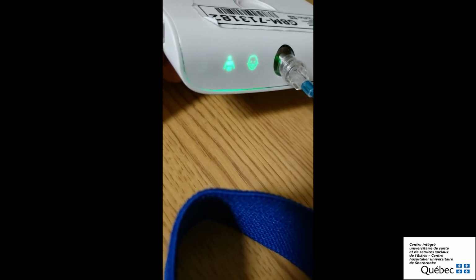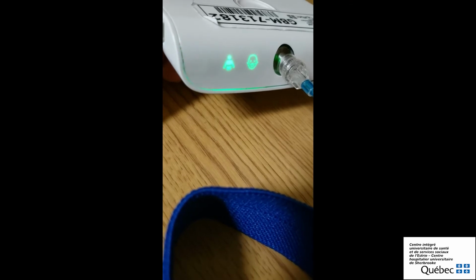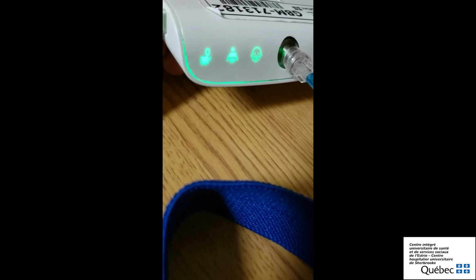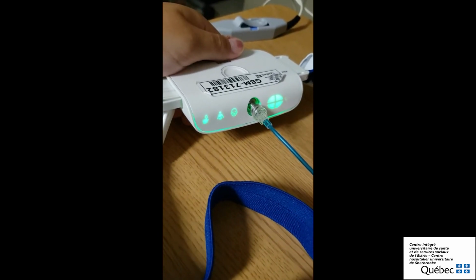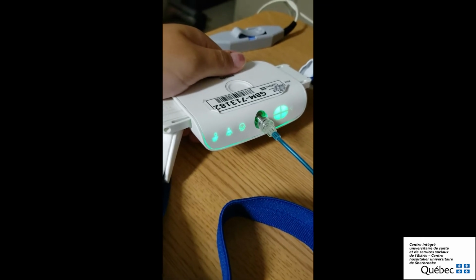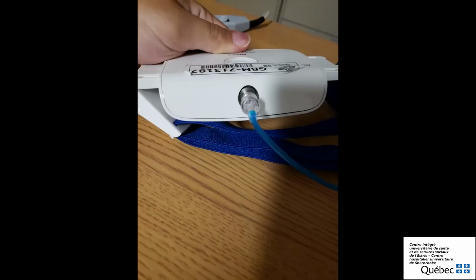When everything is green, this means everything is recording properly. You will even see the quarters light up green. After this, the lights will close themselves so as not to bother you during the night. If you wake up and notice a light, you'll have to reposition the sensor. Now let's take a look at how to install the machine.